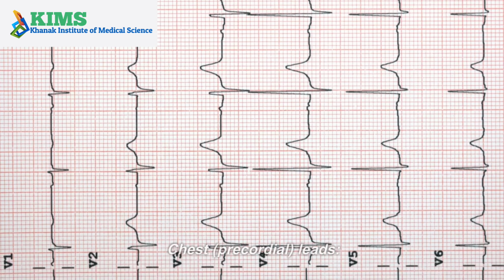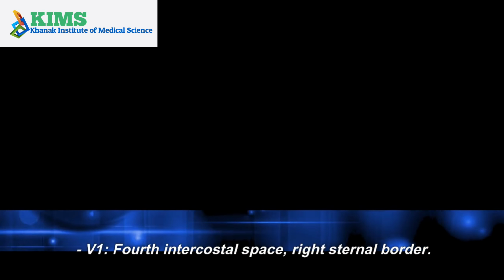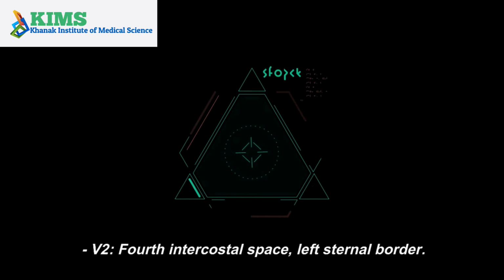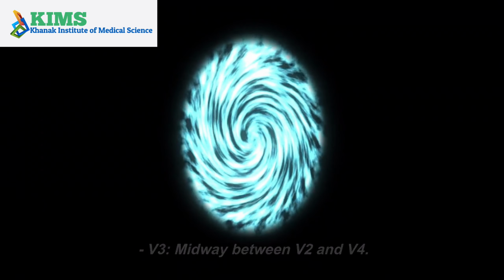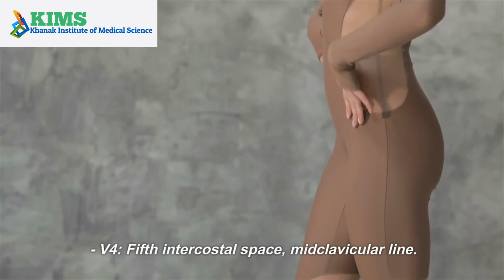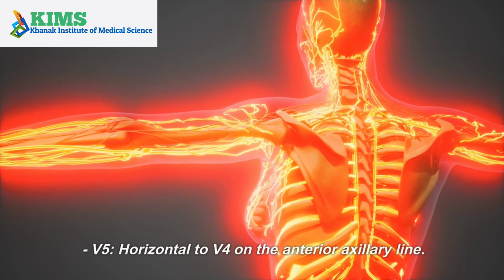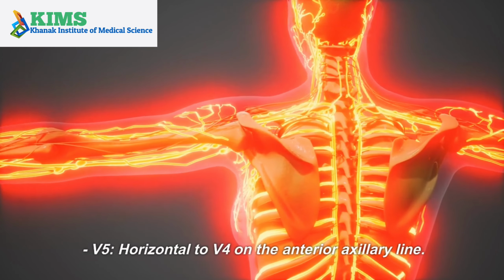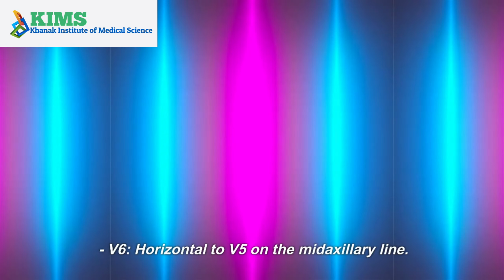2. Chest, precordial, leads. V1, fourth intercostal space, right sternal border. V2, fourth intercostal space, left sternal border. V3, midway between V2 and V4. V4, fifth intercostal space, midclavicular line. V5, horizontal to V4 on the anterior axillary line. V6, horizontal to V5 on the midaxillary line.